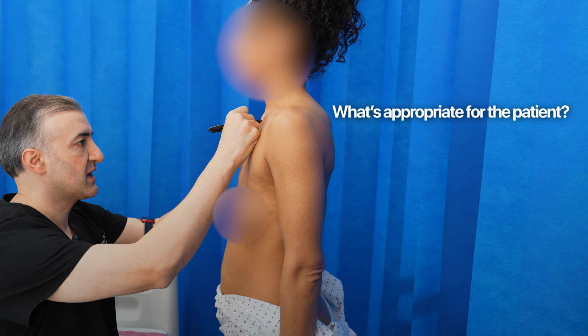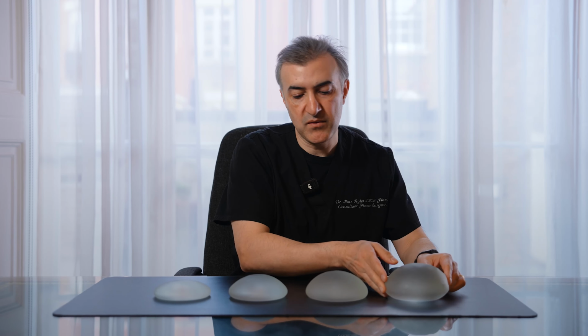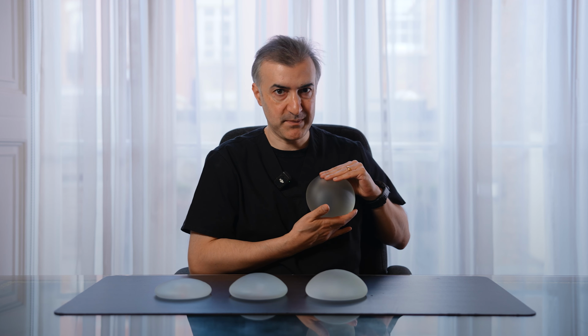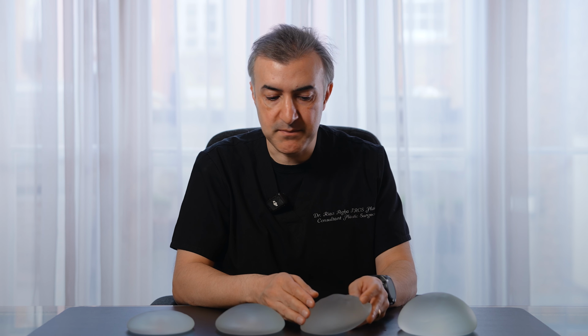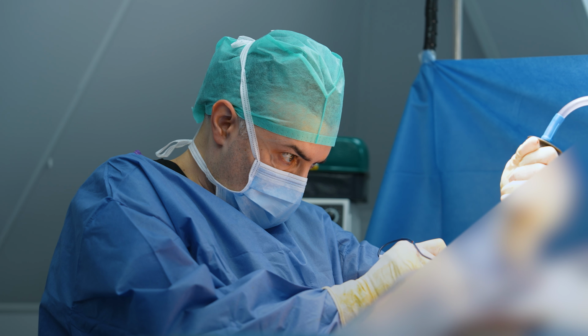And that projection is something that we measure, and we can see what would be appropriate for a patient. What are they looking for? What are their goals? So the projection that we choose is going to be directed by the goals, but also directed by the patient's anatomy. For example, could you fit an implant this big in? Are they going to have enough skin and soft tissues for you to accommodate it? If not, then you can't really place this one. You may have to choose something that is more in line with what they can fit in their pocket, or the pocket that you will create as a surgeon.